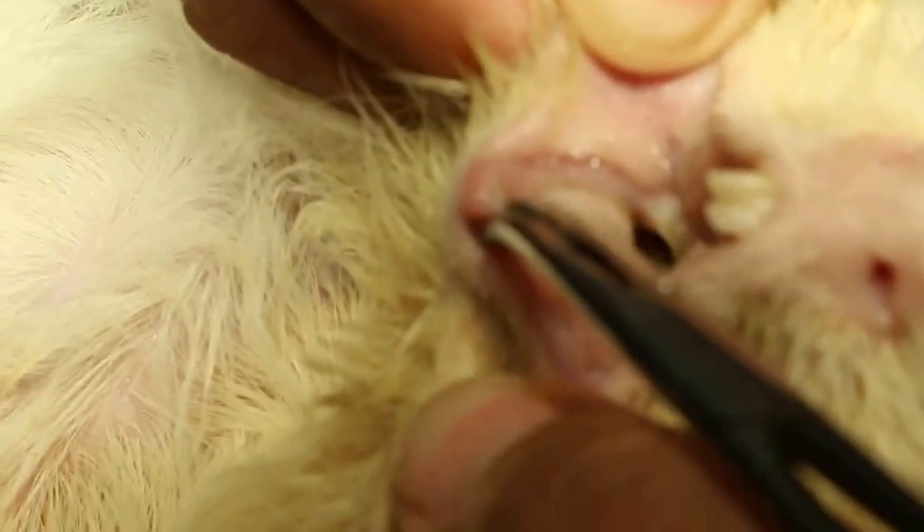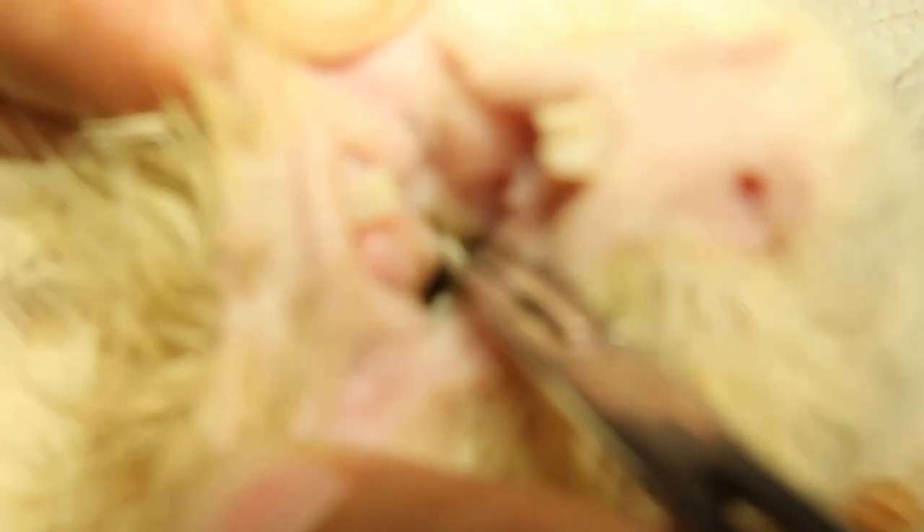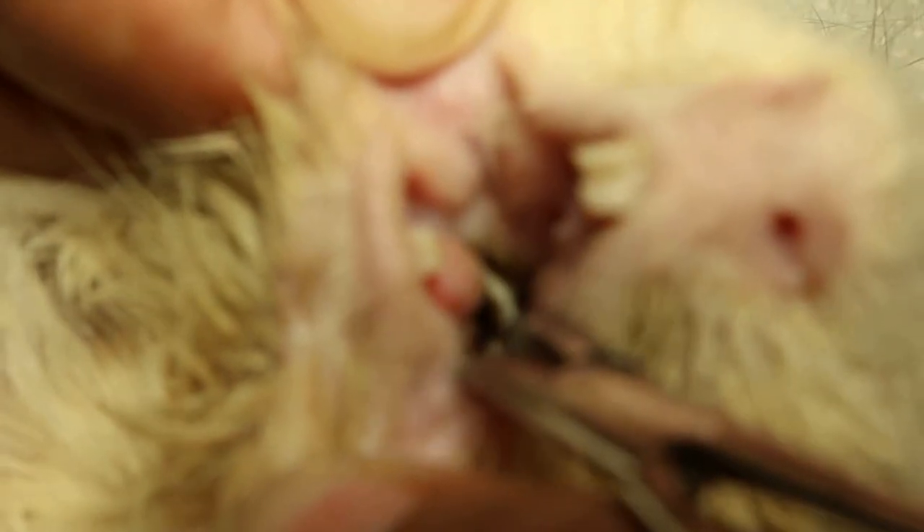We just open up first to see. I open this side to check carefully the teeth — this side is okay. We check both sides, and to check properly it needs anesthetic. Now I pull the tongue and you can definitely see the molar spur on the right lower teeth. I point to here with the forcep — this is the molar spur of the right lower molar.